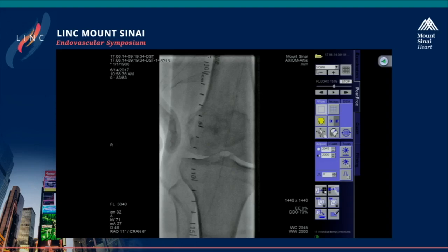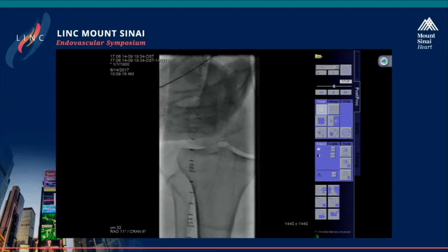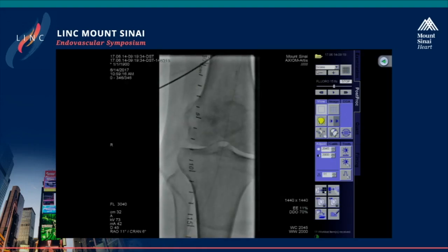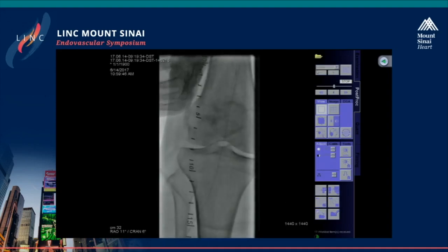I agree. I think the proximal lesions we were definitely planning on just leaving alone. But the distal vessel, right of the adductor canal and below, is the area where we felt we're probably going to have to do something. We talked about laser, but here we decided to go with directional atherectomy because the IVUS shows really well that it's mostly plaque, and we seem to have crossed pretty centrally luminal and without being in a dissection plane. I don't know if my IVUS team agrees with me. Guys, we're pretty luminal, right? Yes. Okay, good. So at this stage, I'm just going to pass a directional atherectomy catheter.